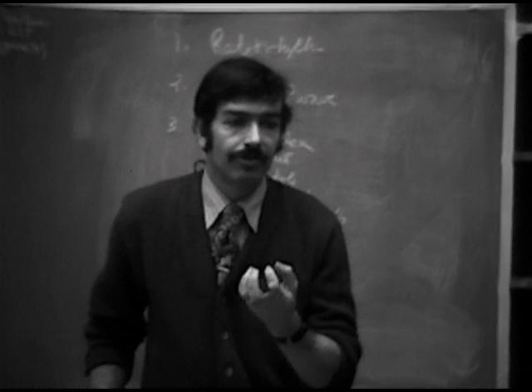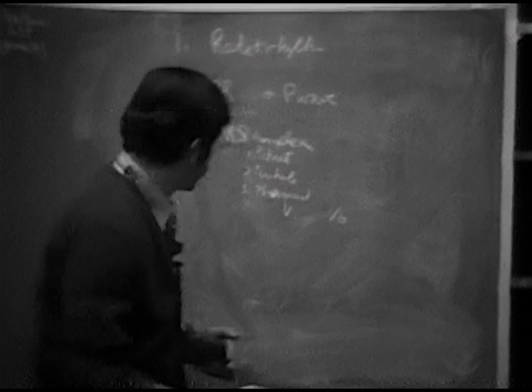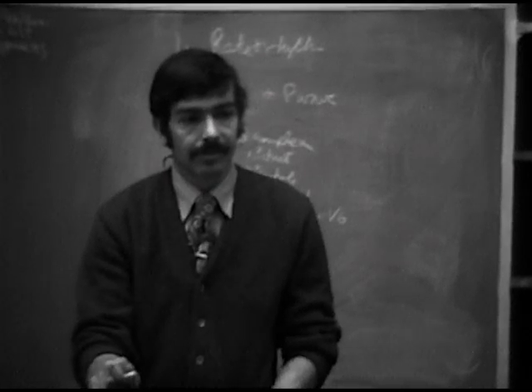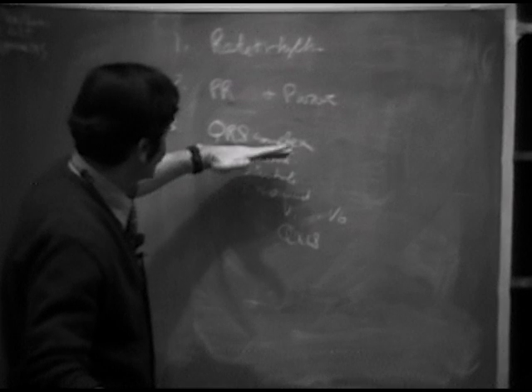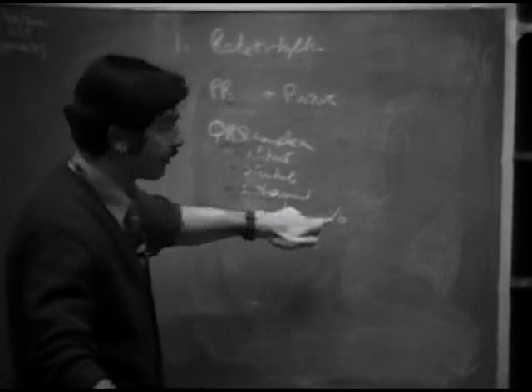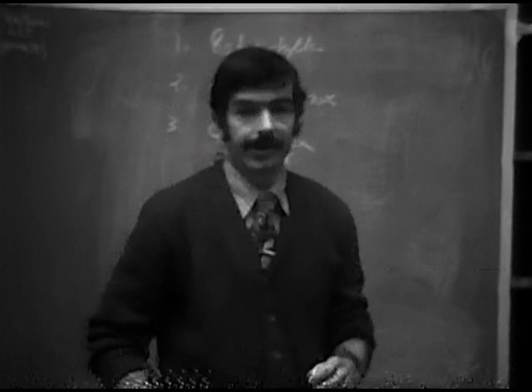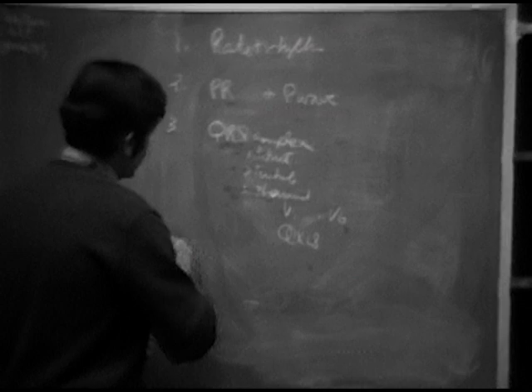Once you've decided that you're dealing with a right or a left bundle branch block, you go back to the frontal plane and you look at the axis. That'll tell you whether you're dealing with one of the hemi-blocks or a combined block. So if you just go through this routine: QRS wide, initial, the whole thing, the terminal thing. If it's terminal, look at V1 and V6. Decide whether you're dealing with a right bundle or a left bundle. Then look at your axis to see whether you're dealing with an anterior or posterior hemi-block or a complicated block.